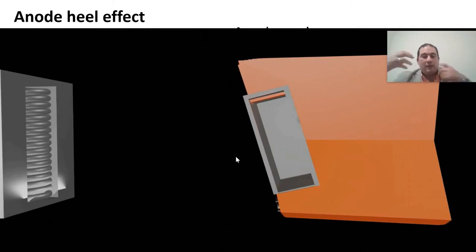Why is it important? Because you need a large number of photons to create interaction. For example, you might find at your cathode 120% intensity, and you will find at the anode 70%. The difference in intensity is very large. The difference in intensity is very significant. So even if the mean energy is higher, it did not solve the problem. It did not compensate for the issue because you are still talking about energy. You are talking about penetration.